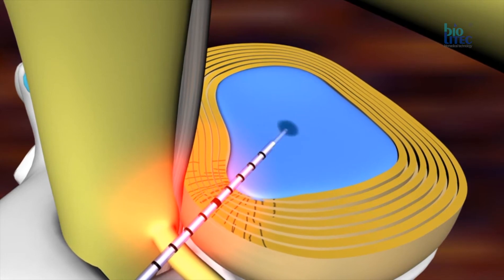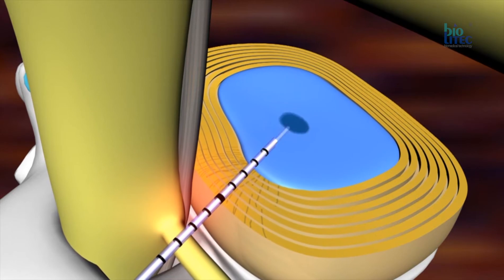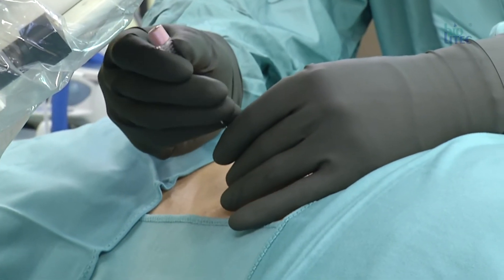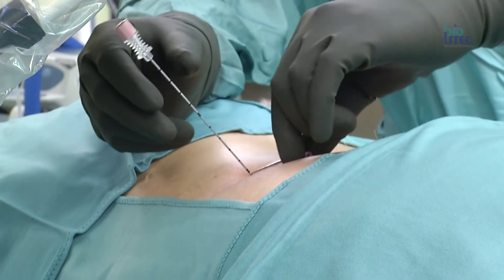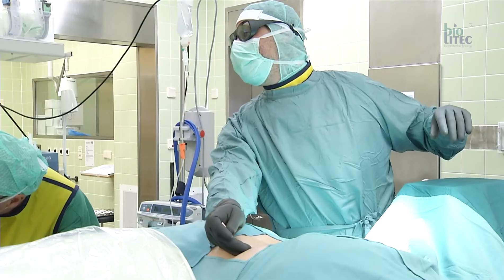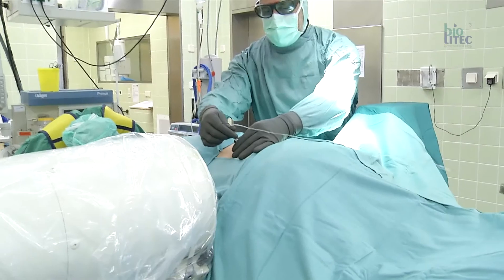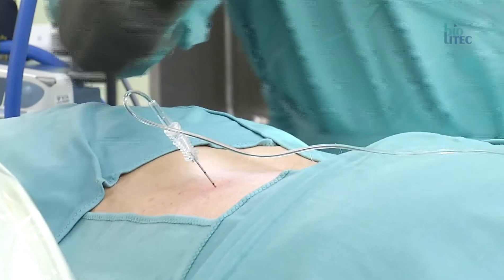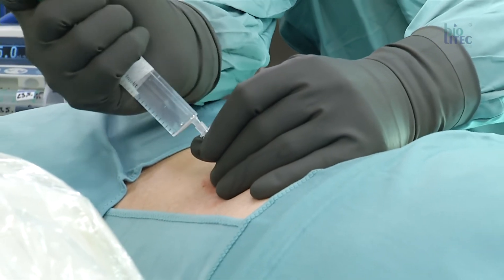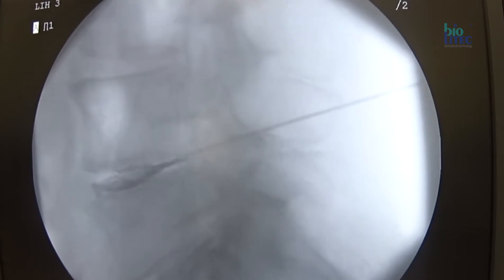Post-nucleotomy syndromes are also very treatable. The nucleotomy at the lumbar spine is carried out with an 18g needle under fluoroscopic guidance after local anaesthesia. The right position of the tip is the dorsal one-third of the discus. It is important to maintain a parallel alignment of the needle between the vertebral bodies. The right position should be controlled in AP and lateral view. A discography with contrast medium leads to further information about the condition of the discus. A memory pain test, which is a provocative test because of an intradiscal pressure increase, is also a good diagnostic tool and is routinely performed before treatment.